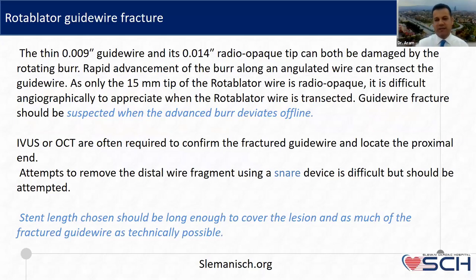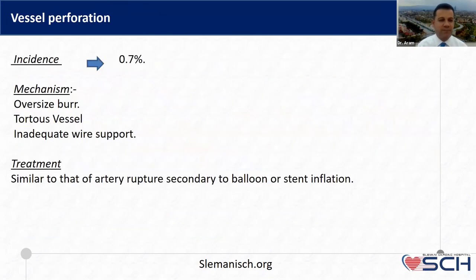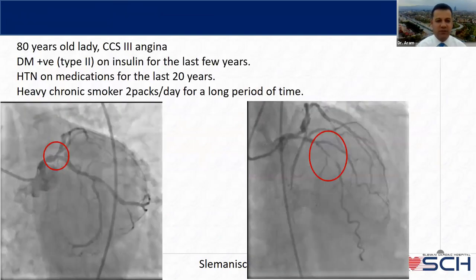It cannot be, we are going to snare it, or sometimes we are going to cross it with the long stent to fix it with the wall of the vessel. Vessel dissection, same treatment. Vessel perforation, same treatment. We don't have anything special for that.